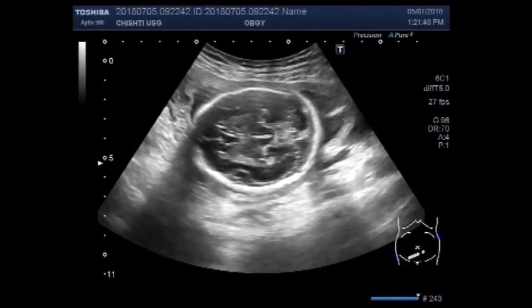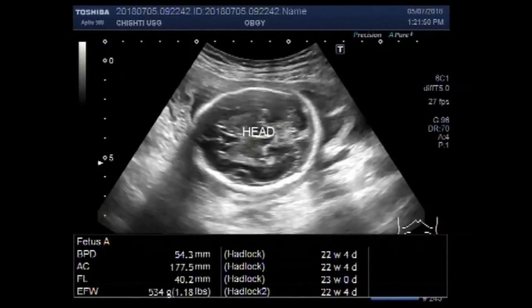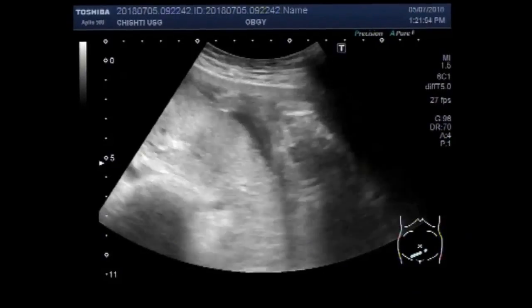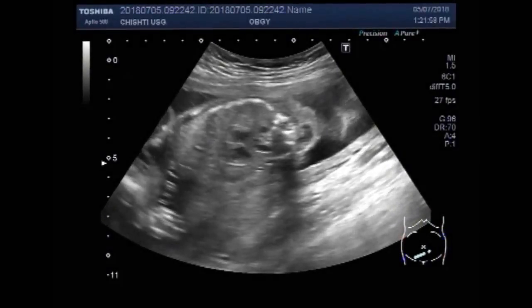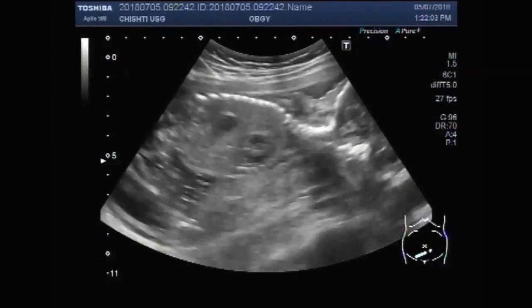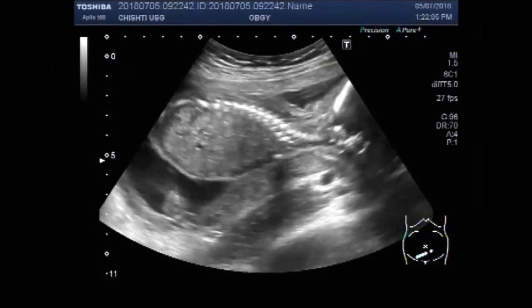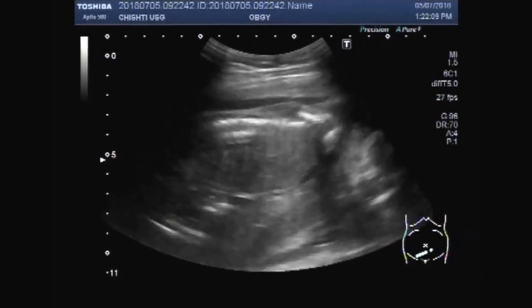You can see this normal intrauterine pregnancy and the head of the fetus. The pregnancy measures appropriately. You can also see the fetal heart and fetal cardiac activity.